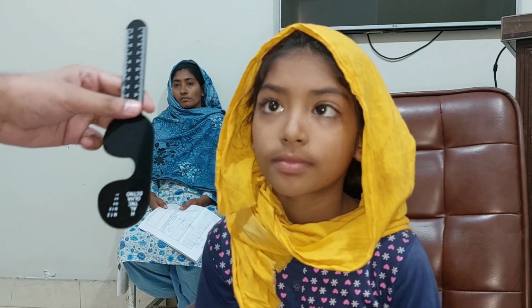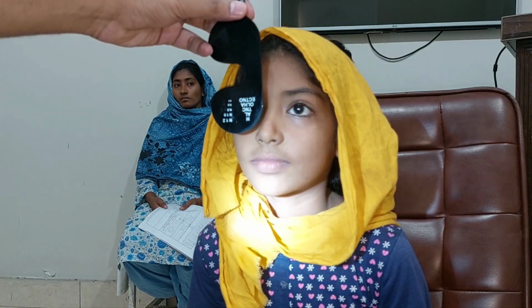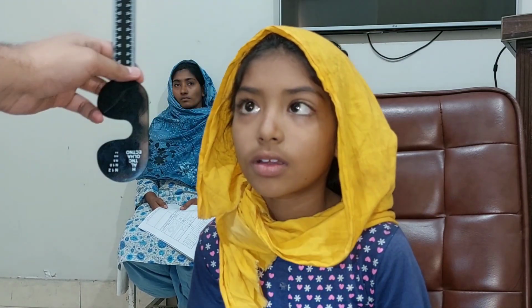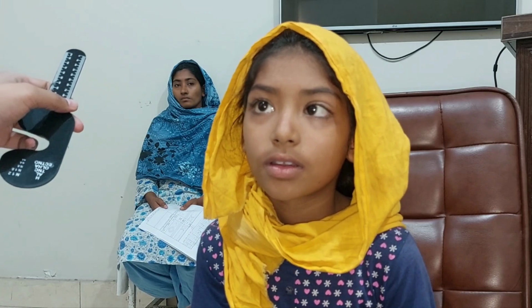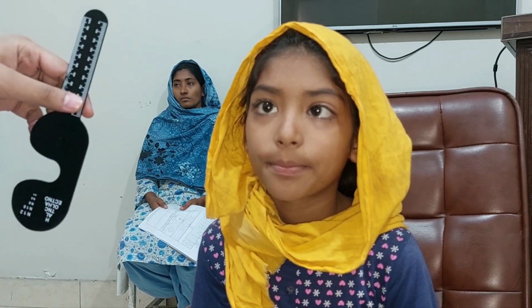Do it again. Look in front. The left eye is deviating. Performing the cover test, the left eye is fixating. And then remove, the left eye is again deviating. Exactly. So only the left eye is at fault. So this is a left convergent squint, right? This is a unilateral squint. This is not an alternating squint.